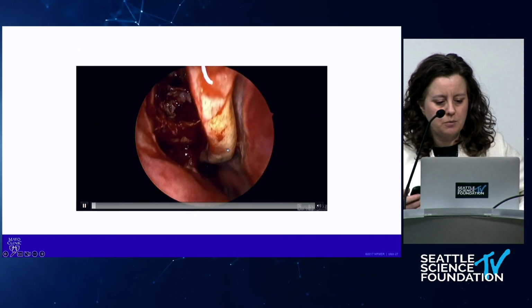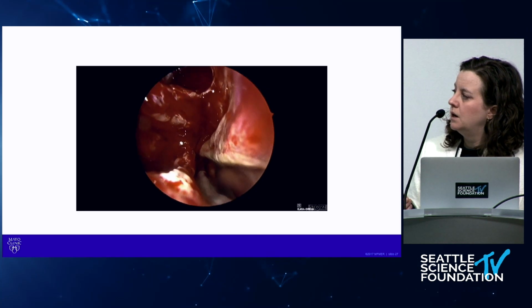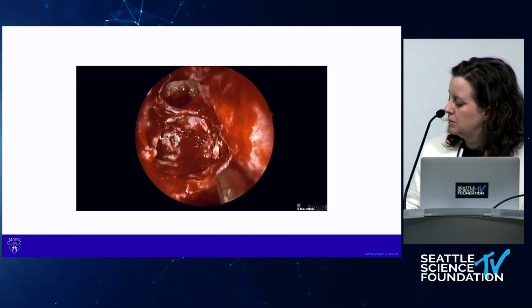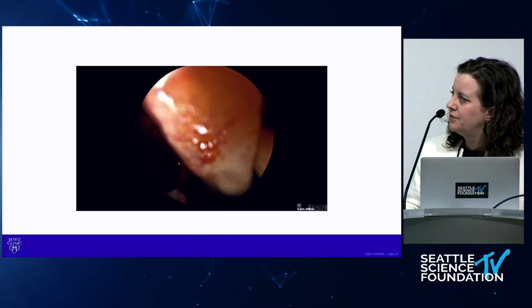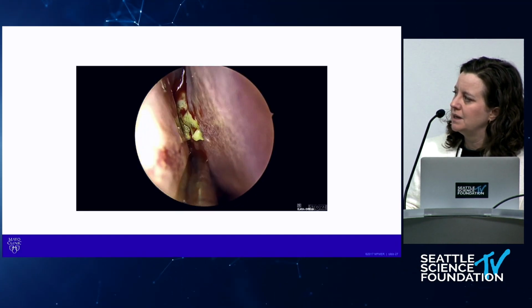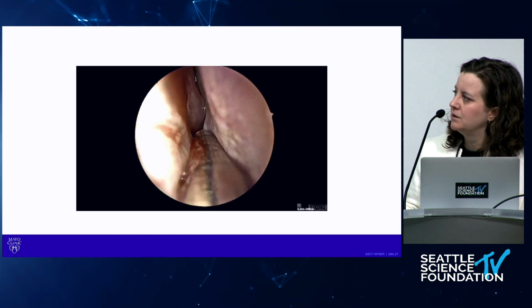This is a different patient. He's got chronic sinusitis, really diseased mucosa. I'm going to show you 2 ways to get to the sphenoid. So we've dissected the posterior ethmoids. Superior turbinate's here, but it's a mess in there. It's bloody and it's inflamed, and I'm not finding the superior turbinate. That's because this gentleman has a huge fungus ball in that sphenoid. There's pus, it's inflamed. We're going transnasal.